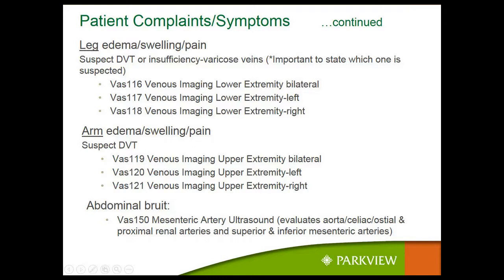Leg edema, swelling, pain, suspect DVT or insufficiency. It's important for them to state which one. The reason being is insufficiency studies take a little bit longer, and a lot of times we have 2 people in there because when we do an insufficiency study, the first thing we do is rule out a DVT because the DVT sort of trumps insufficiency. If they have a DVT, we need to address that. So we have the patient come in, they're laying down, we do an ultrasound ruling out a blood clot, no DVT. Then we stand the patient and we put a blood pressure cuff around their calf or their ankle, and we put the ultrasound probe over the vein and we squeeze and release.